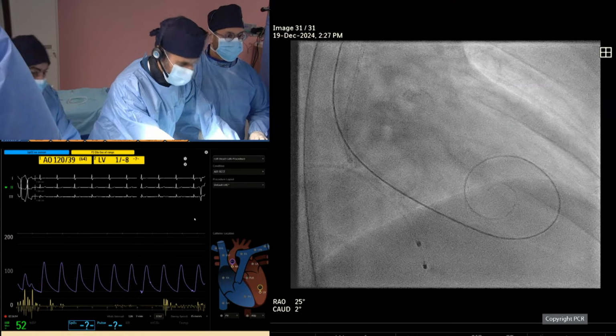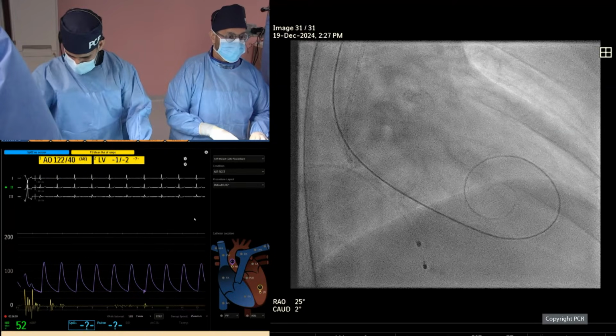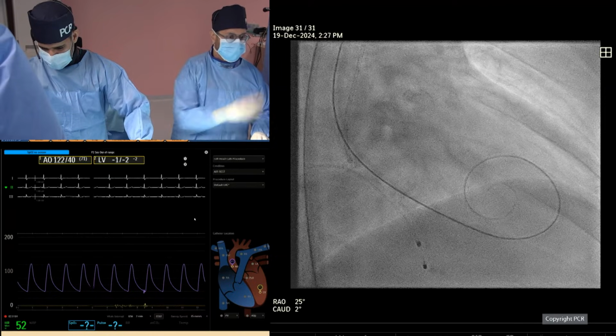Ideally, we should be using, like mentioned, the extra small. A lot of our patients are severely hypertrophied in their ventricles, but this one seems to work fine as well.